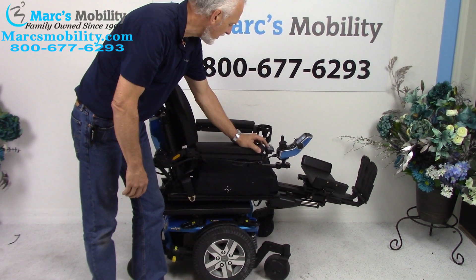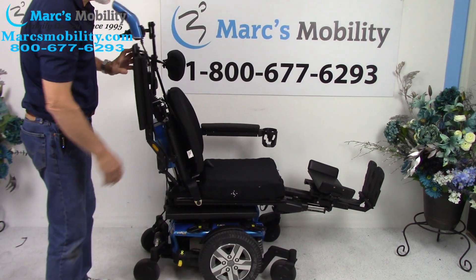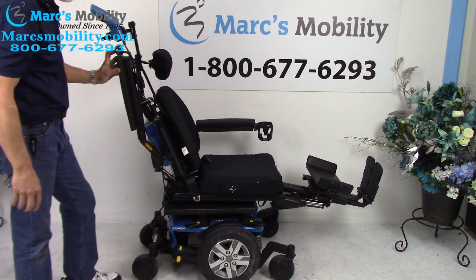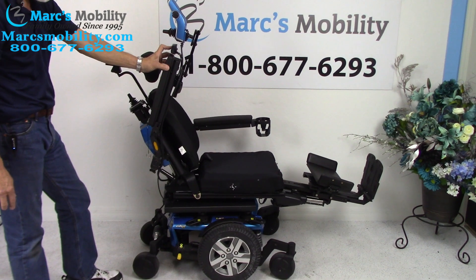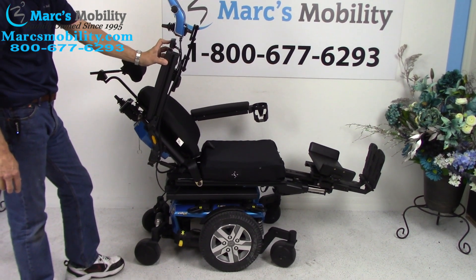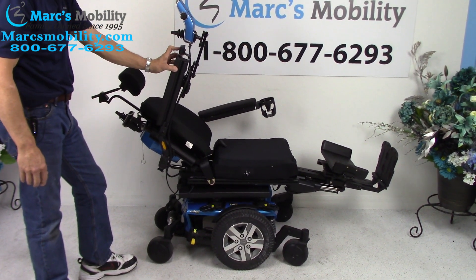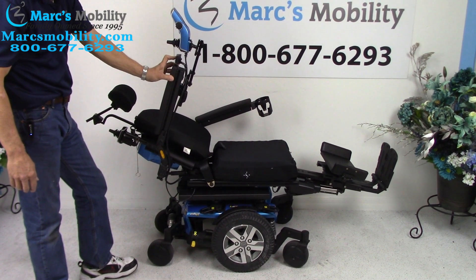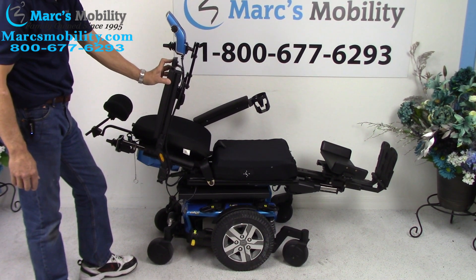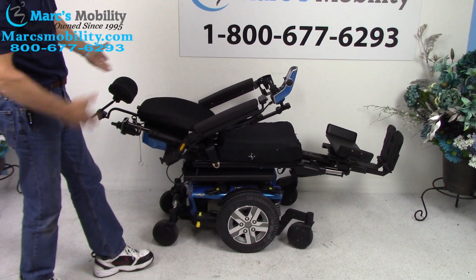The next thing we're going to do is the electric recline. The electric recline is just the back going back by itself. If you were laying down flat in your chair, that's what it would look like — it's pretty much flat. This is what it would look like if you've completely laid down in the chair.